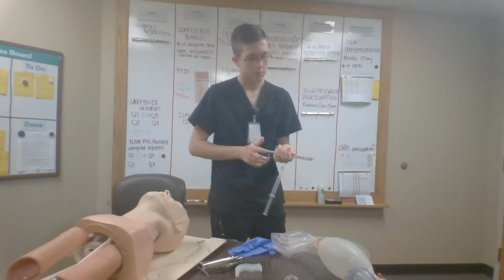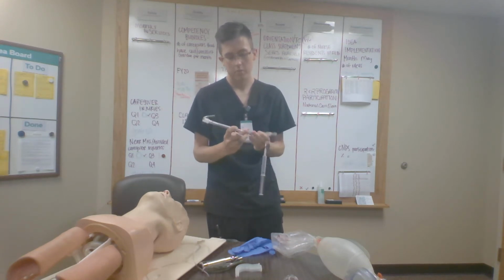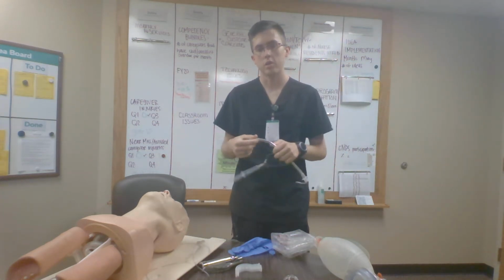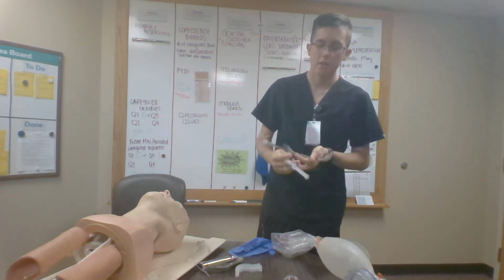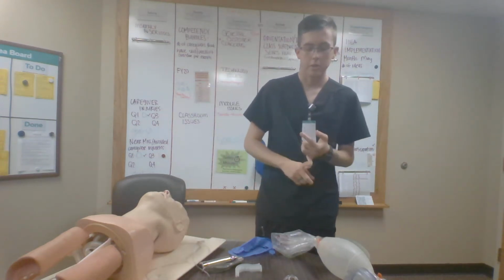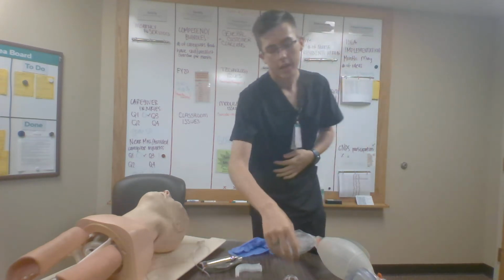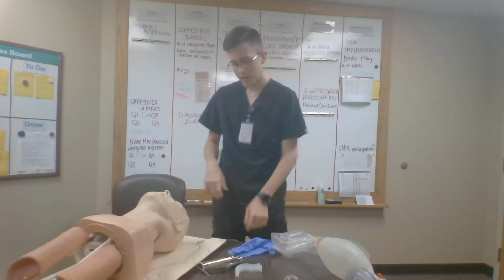So for most adult patients, you want to use about a 6.5 to 7 ET tube. This one's currently an 8, which an 8 can be used for more of your larger type patients. And then for pediatrics, it goes significantly smaller. You also want to make sure that you have capnography, some form of an airway adjunct, and then your rigid tip suction as well as your flexible catheter suction.